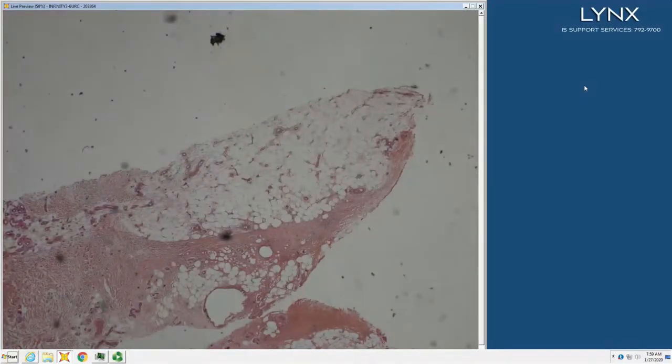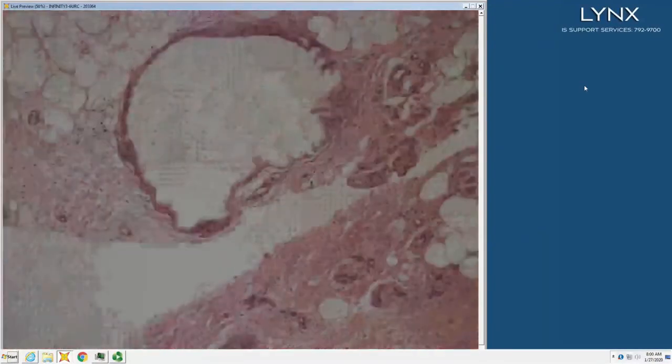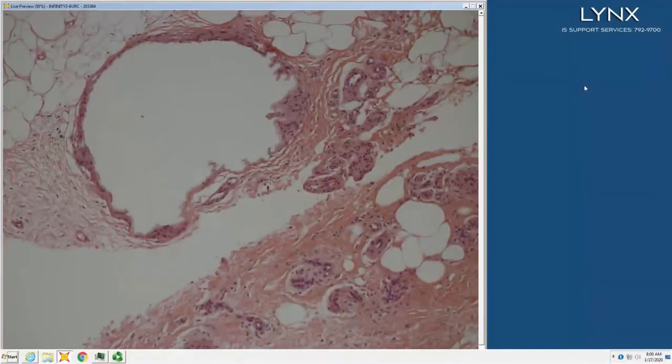So there's some fat. It doesn't look very happy. Unhappy fat. Oh, it's like lipomembranous change. Lipomembranous change and cystic fat necrosis makes you think of, oh yes, lipodermatosclerosis. Well done. Keep that easy button going. Choose a different language.